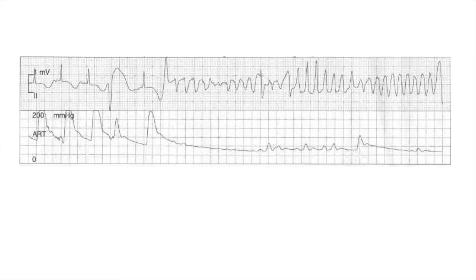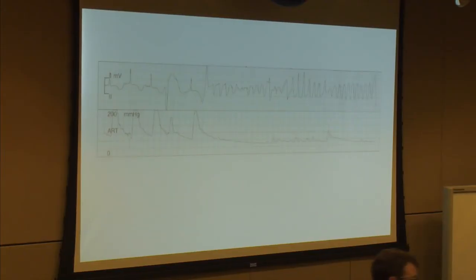Here's another example. Is mag pretty ineffective? Give mag, shock them, give mag, right? Is it ineffective as a prophylactic mag, like if you notice long QT and you don't want them going into torsades? I don't know. You can draw it up and have it ready, I suppose. I don't think I would give it.